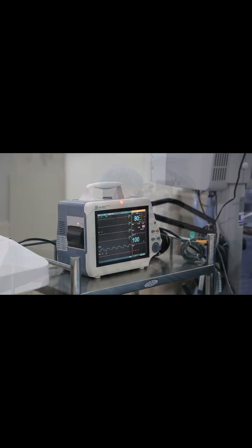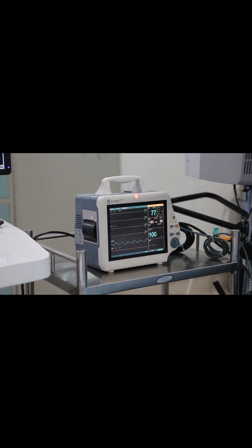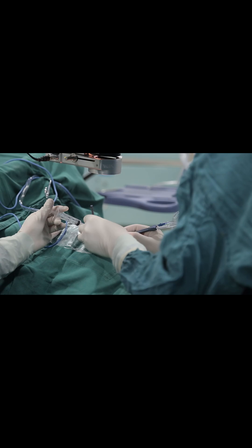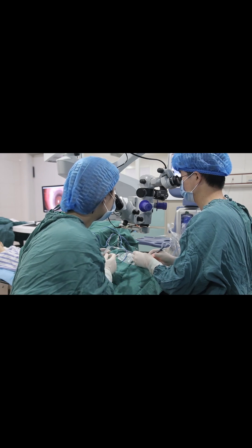Since a corneal abrasion — a scratch or scrape on the front of the eye — is created when the surface cells are removed, the recovery can be pretty painful. The bandage contact lens helps because it covers the exposed corneal nerve endings, but patients can still experience severe pain.